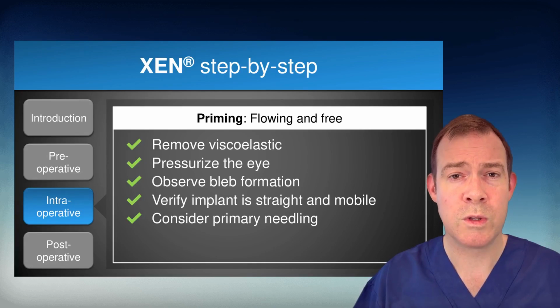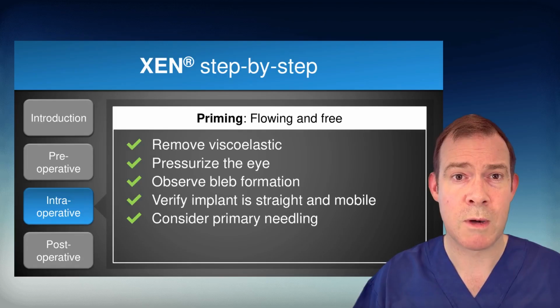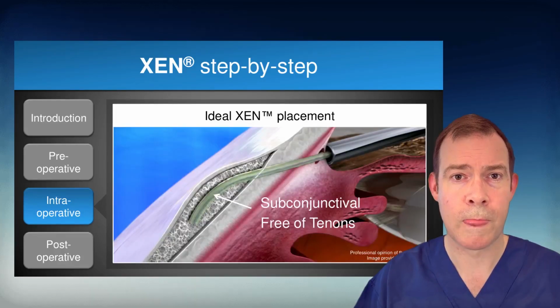Priming, we want to ensure that the XEN is flowing and free before leaving theatre. We do this by removing viscoelastic thoroughly, pressurizing the eye, ensuring that we see a visible bleb at the time of surgery, verifying that the implant is straight and mobile, and certainly consider primary needling if the XEN does not appear to be free and mobile, because we don't want the XEN caught in tenons.